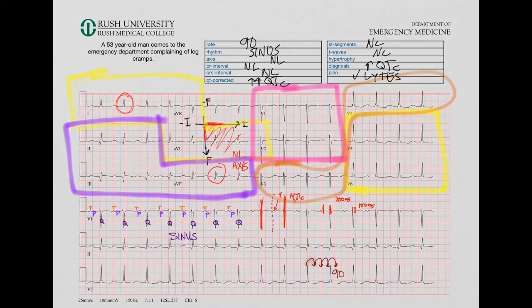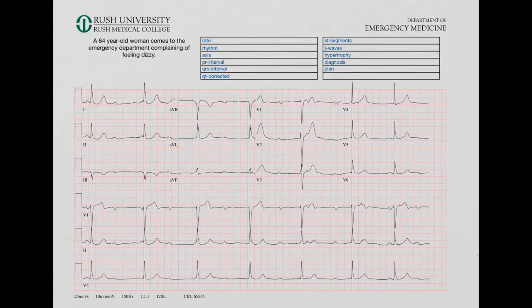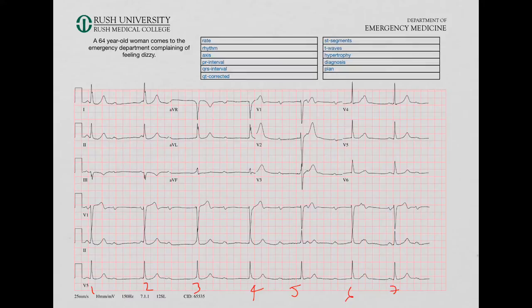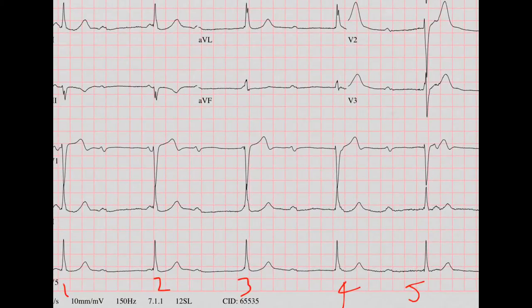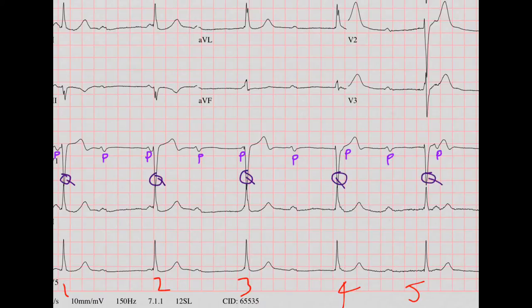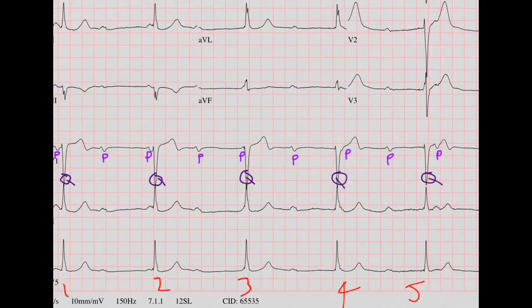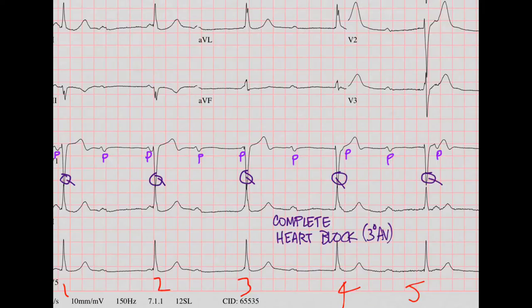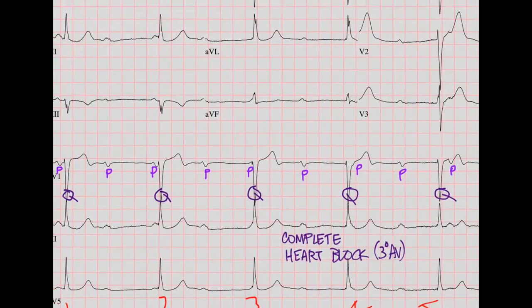Let's go to the next EKG. Let's start with the rate — counting QRS complexes: 1, 2, 3, 4, 5, 6, 7. So 7 times 6 is 42, so we'll say the rate is 42. For rhythm, let's zoom in on this section and label everything. You can see there's not one P for every QRS and one QRS for every P — in fact, they seem to be doing their own thing. The QRS complexes are marching out in a steady regular rhythm, and the P waves are marching out in their own steady regular rhythm. They're not talking to each other; each is beating to the beat of its own drummer.